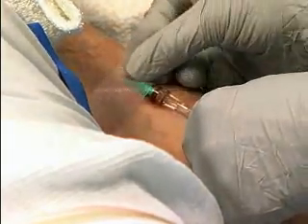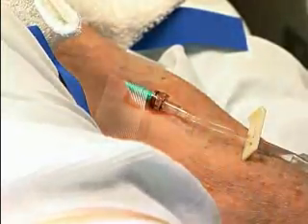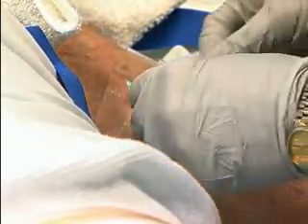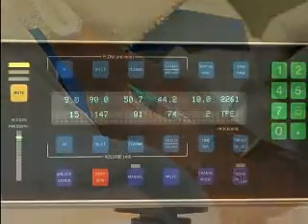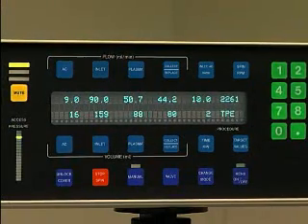At our center, we use the venous access as our first choice, but if we run into problems where we do not get a good blood flow, or if you have problems getting a 16 gauge catheter into the vein, then we use the radial artery for access.